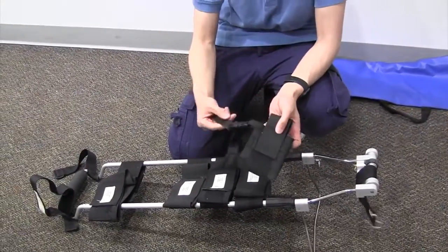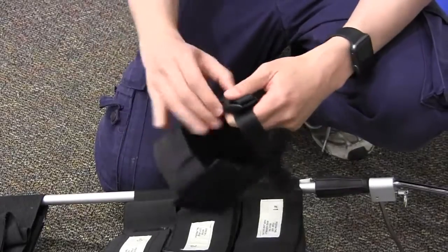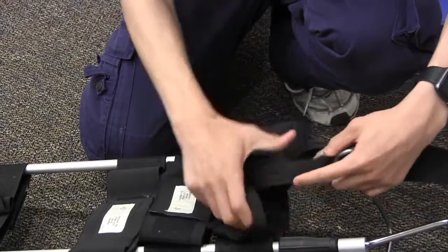And here is the ankle hitch, which you apply on the ankle. This will be attached to the traction apparatus.